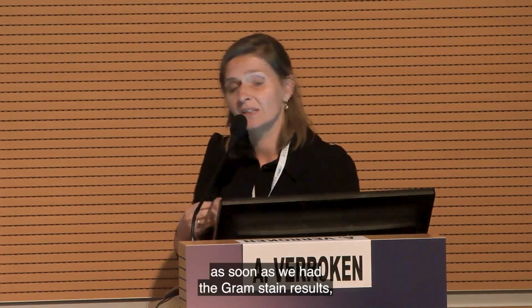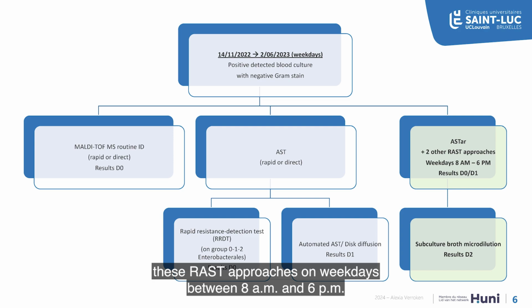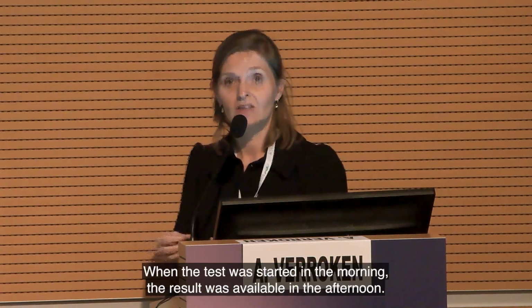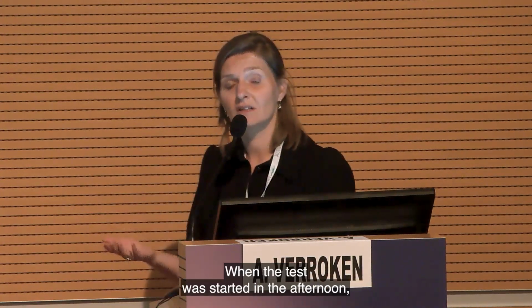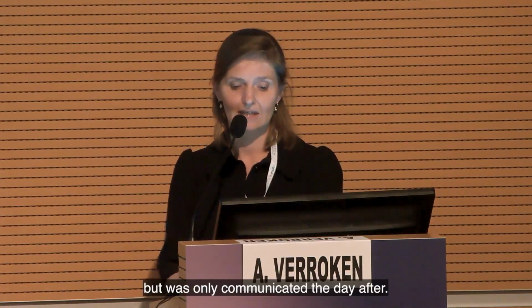We initiated these RAST approaches as soon as we had the gram stain results, on weekdays between 8 a.m. and 6 p.m. The earlier we started the test, the earlier we had the result. When the test was started in the morning, the result was available in the afternoon. When the test was started in the afternoon, the result was available during the nighttime, but that was only communicated the day after.